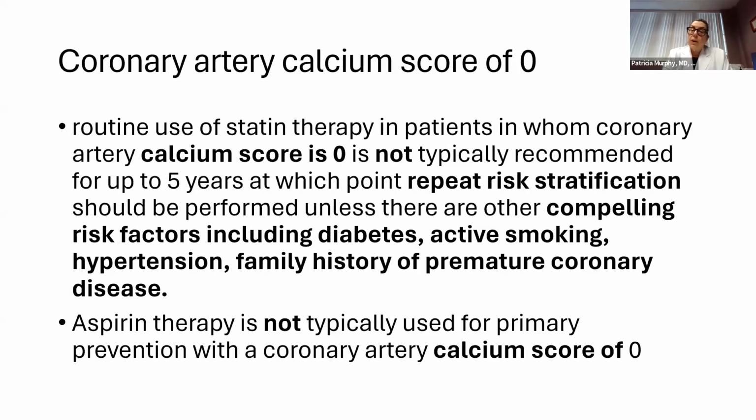So, coronary artery calcium score of 0. Remember, this is a test you'd love to get a 0 on. Routine use of cholesterol-lowering statin therapy in patients with a coronary artery calcium score of 0 is not typically recommended for up to 5 years. So this is a case in which you might consider repeating the test after 5 years.